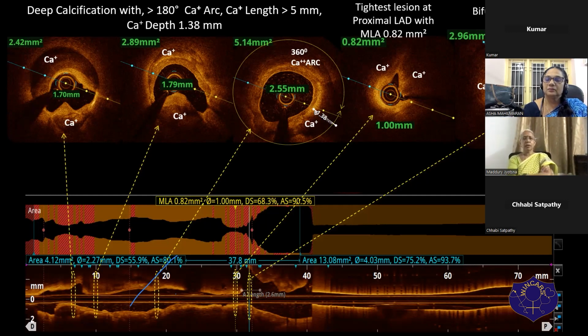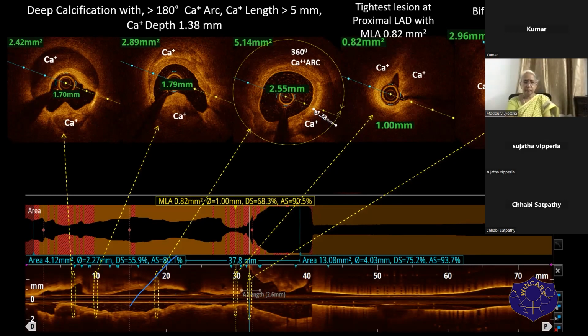My only concern about the rota, Jyotsna, is that much calcium nodule, and I think it needs a combination. We cannot avoid rota. And Rupali has already said there's a good wire bias. You can see the wire hugging. So if rota is the problem, slow flow is less with orbital. Sarita should tell me that. If that is the situation with that combination, she can use orbital.